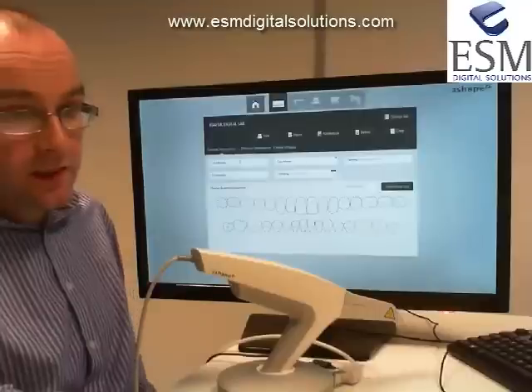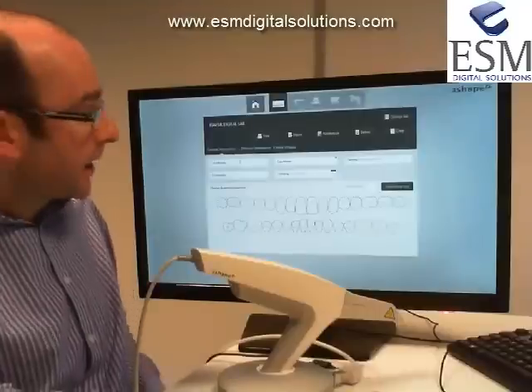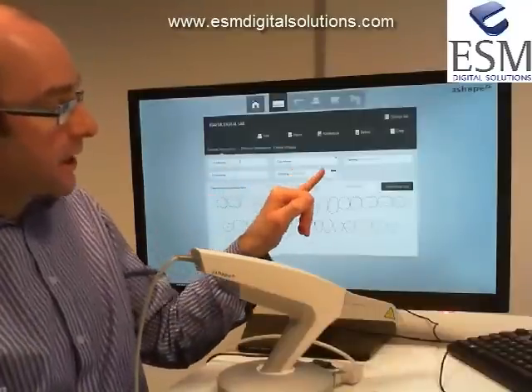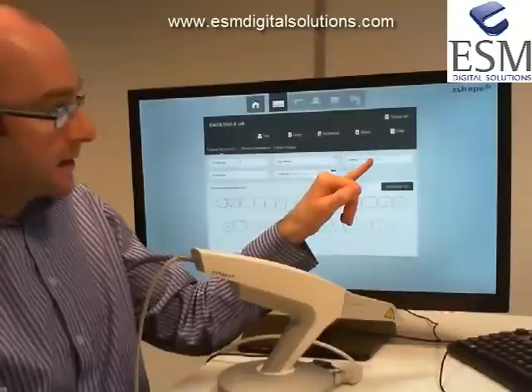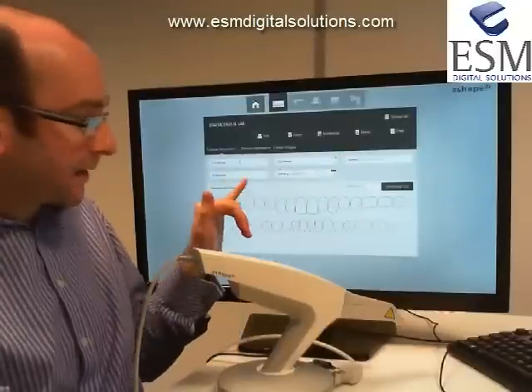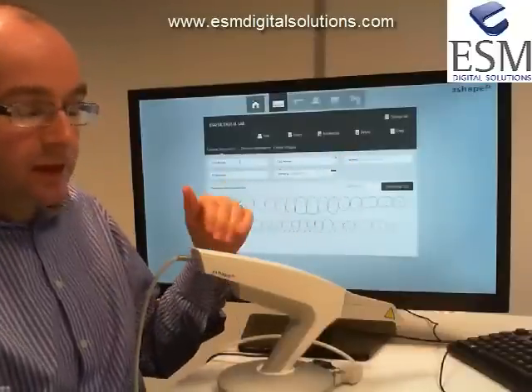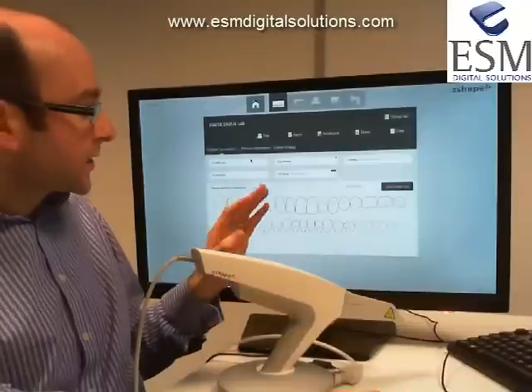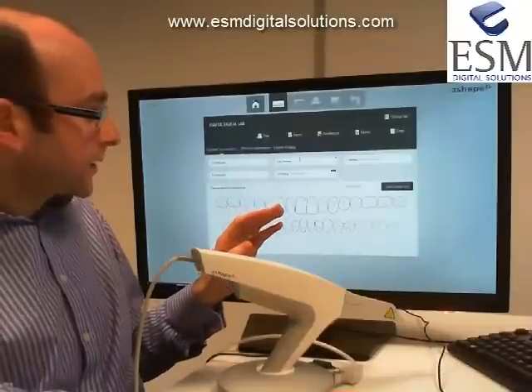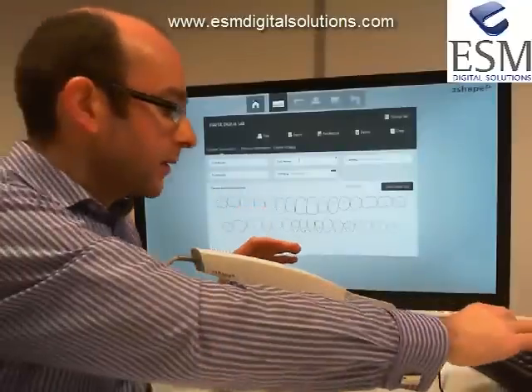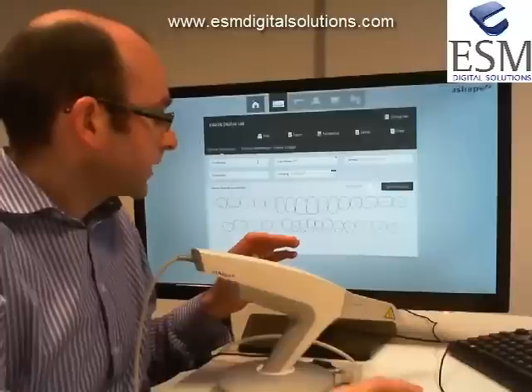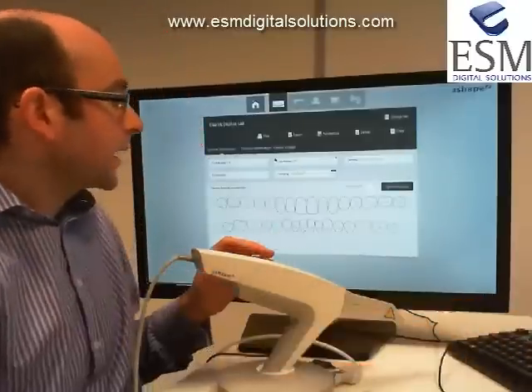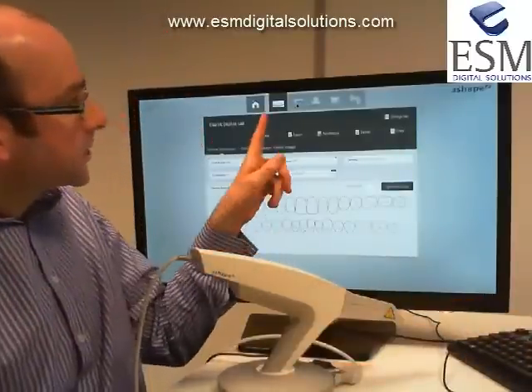The information we need to enter here starts with the patient's ID, first name, and last name. That's it. We can also enter some comments and operator information if we wish. We'll put some figures in there and we're ready to go.